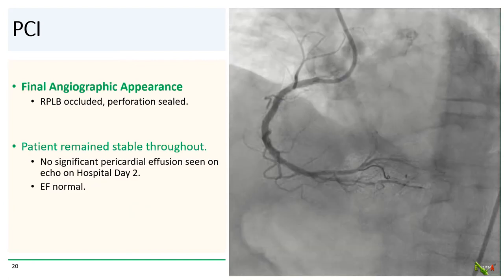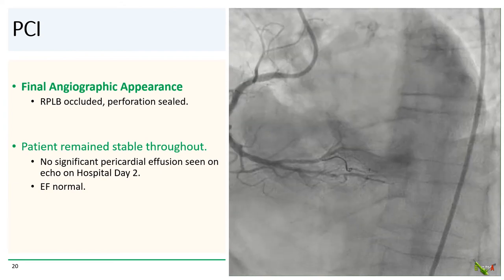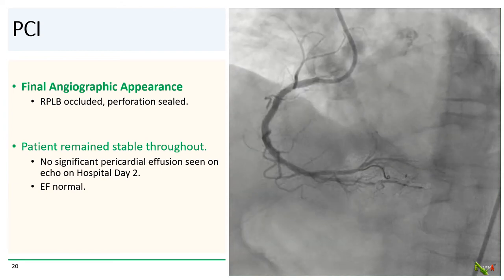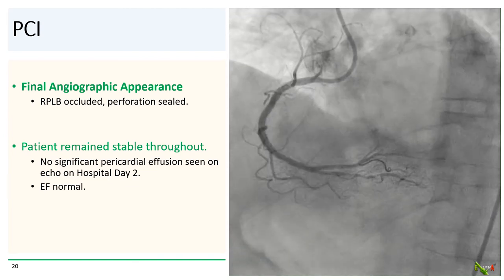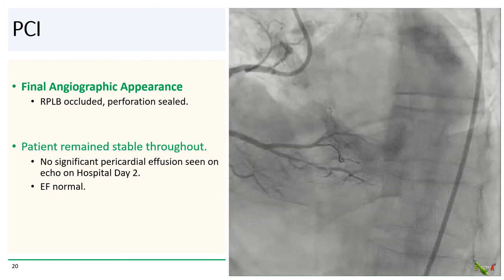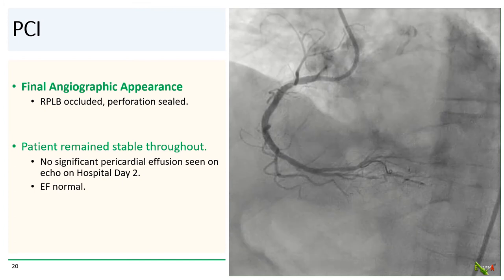Here is the final angiographic appearance. The RPLB was successfully occluded, which sealed off the perforation. The remainder of the RCA looked fine. The patient remained stable throughout the ordeal, with no significant pericardial effusion seen on echo the following day. Fortunately, her ejection fraction remained preserved.